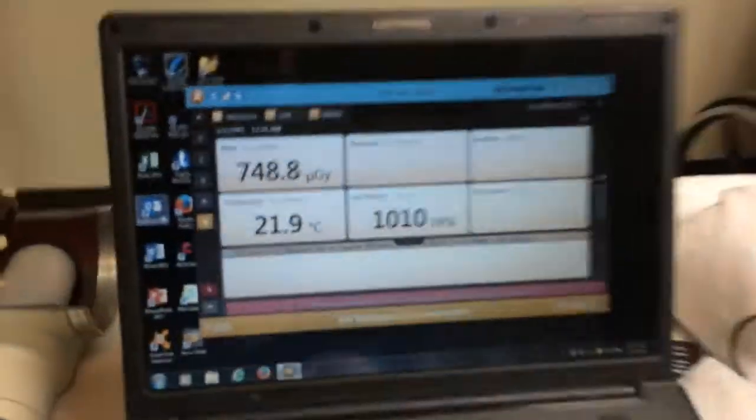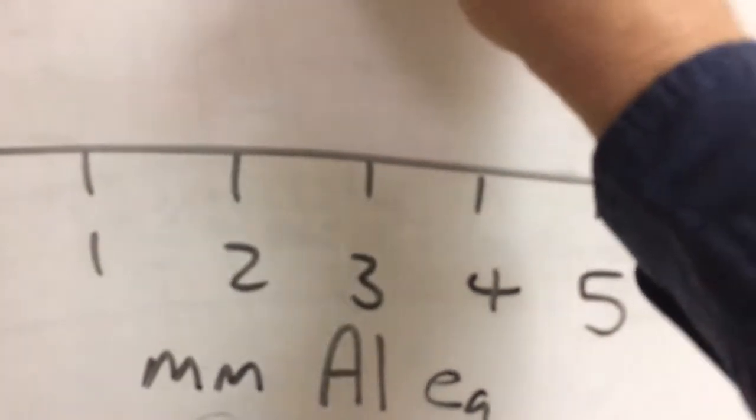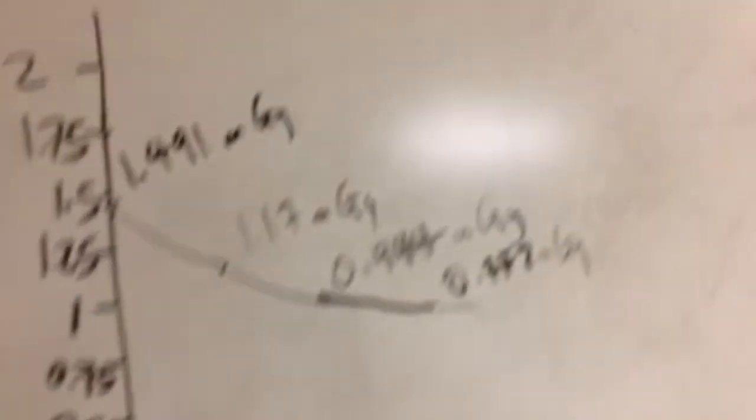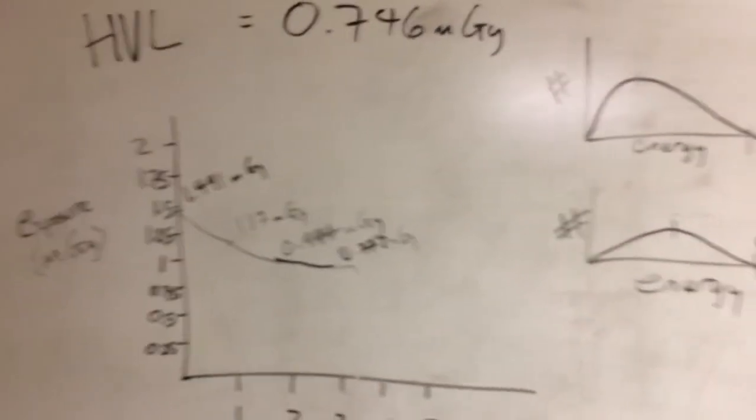Let's see what we got on our ionization chamber. We got 0.748, 0.749, somewhere in there. So we have just arrived at our half-value layer. For this machine, it's about 3.2 millimeters of aluminum. That did put us right at the amount of exposure that we would associate with a half-value layer operating at this energy level.